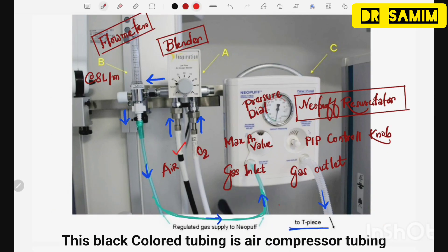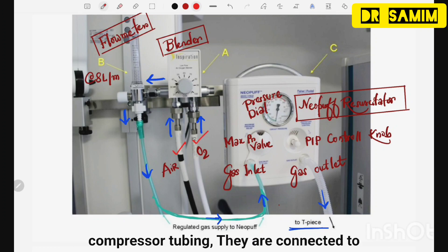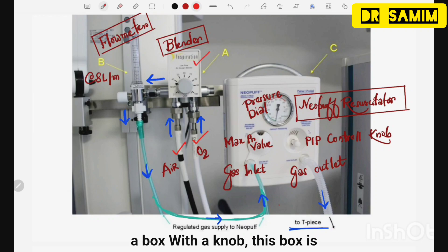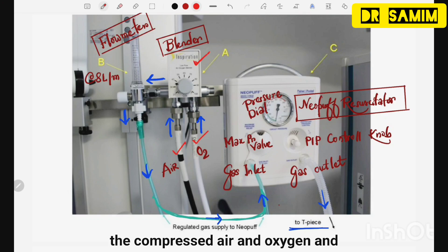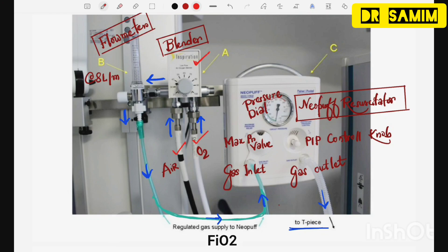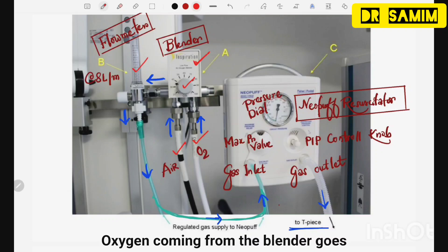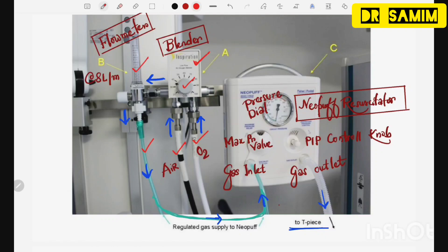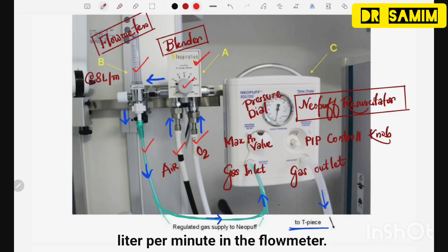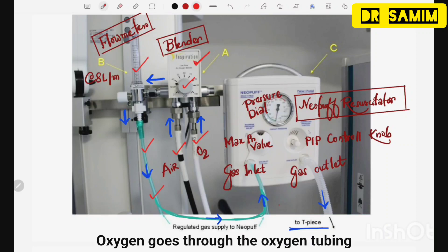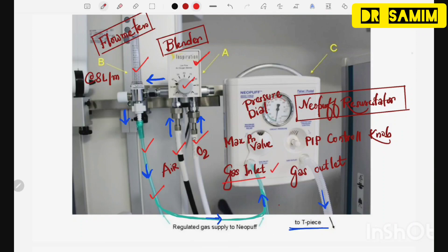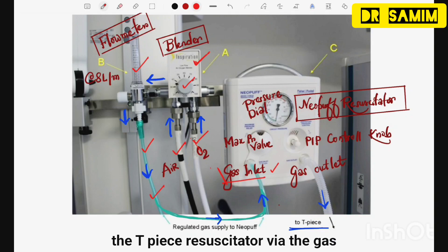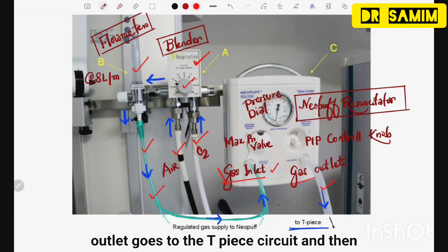This black color tubing is the air compressor tubing, and this white color tubing is the oxygen compressor tubing. They are connected to a box with a knob — this is the blender. The blender mixes compressed air and oxygen to produce the required FiO2, which we adjust by rotating this knob beforehand. Oxygen from the blender goes through the flow meter — we usually set the flow at 8 liters per minute — then through the oxygen tubing into the T-piece resuscitator via the gas inlet, and out via the gas outlet to the T-piece circuit and then to the patient.